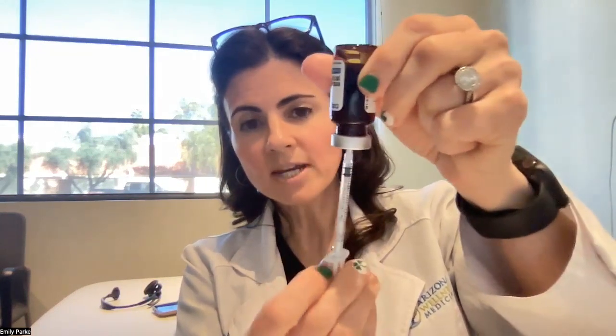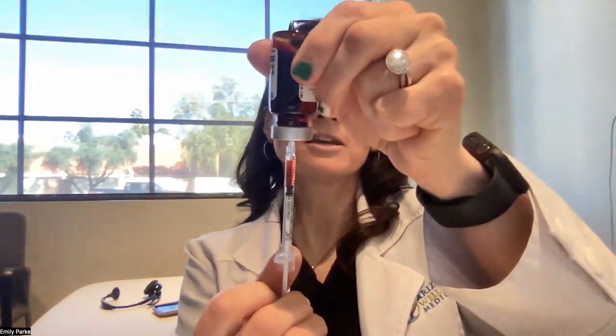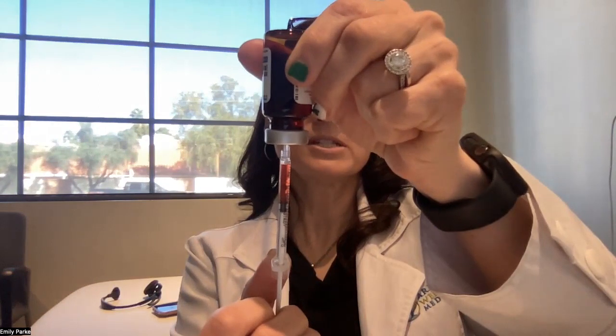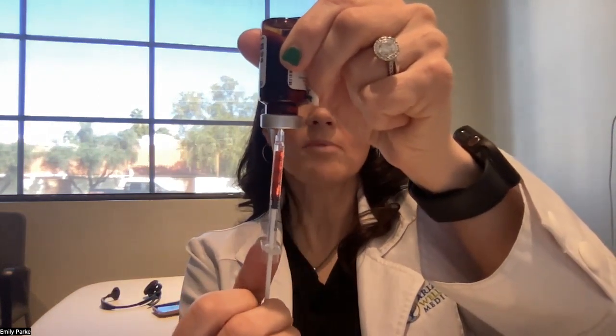Then you're going to turn the vial upside down so that all the fluid comes to the bottom. Next, you're going to draw up however many units it says. So if your prescription says 10 units, 15 units, or 20 units — I'm going to draw up 20 units.